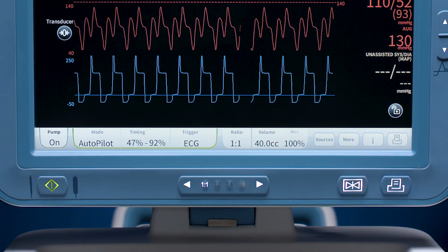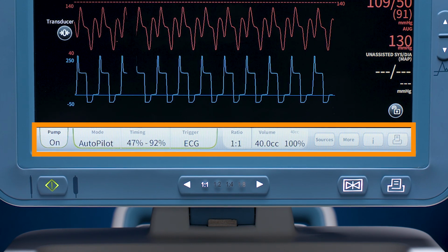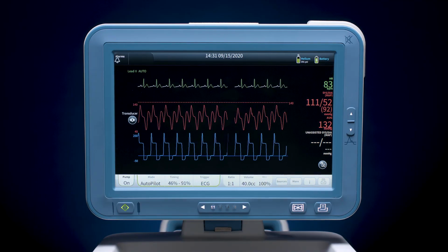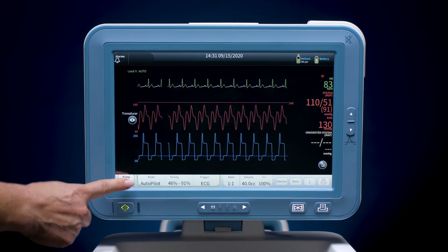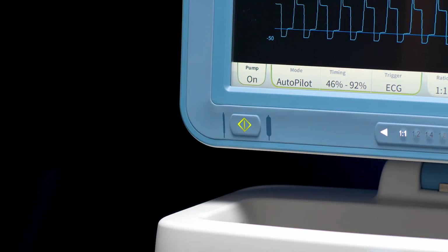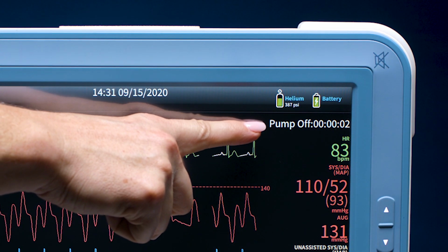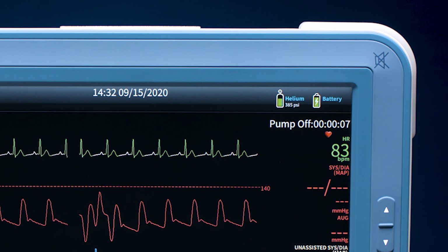The action bar is the main operations menu. The action bar combines the assessment point for IABP operations with the control for changing IABP operations or settings. The controls related to IABP therapy include start-stop pumping. Note, the user can also start and stop pumping by pressing the hard key on the display control head. Anytime the pump stops pumping, a timer will start and show how long the pump is off. The timer shows hours, minutes, and seconds.